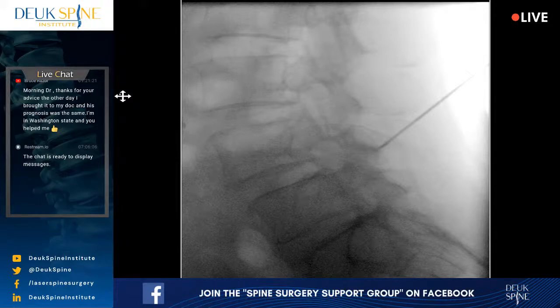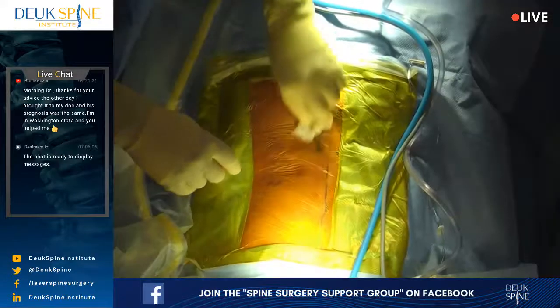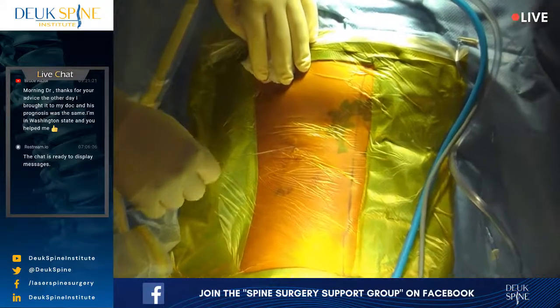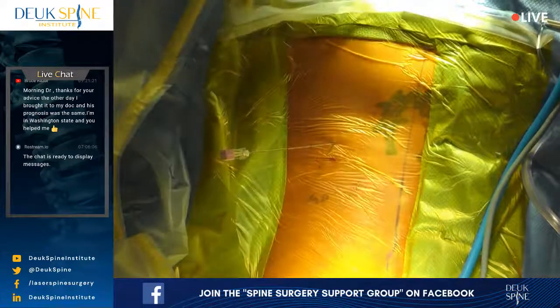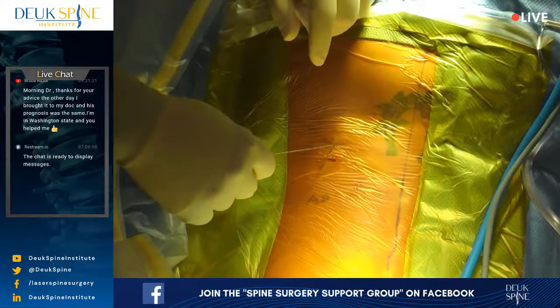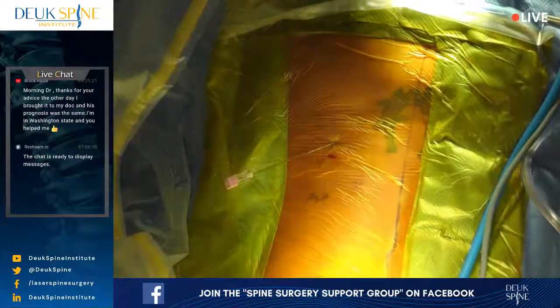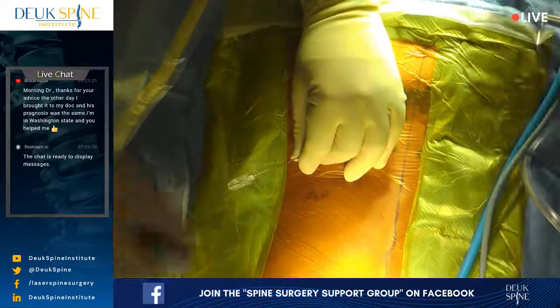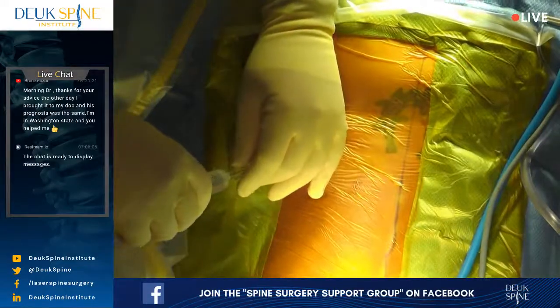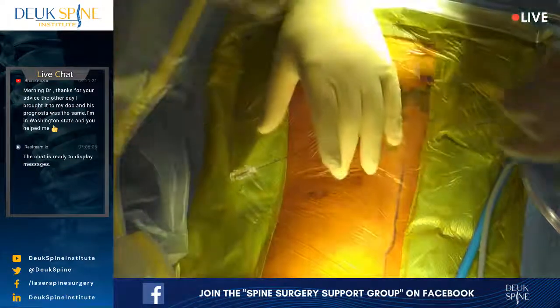You okay? Dr. Deukmedjian here. You're doing great. We're just getting everything set so that we can do this thing perfect for you. You're going to be awake for the first 10 minutes, 15 minutes until we get to where we need to go. I need your assistance, okay? So I'm aiming for the L5-S1 foramen. And if it's uncomfortable, let me know. I'll give you a little more numbing medicine. Okay? And that should make you feel better. Now, we can't use any numbing medicine down by the nerve root, but we're not at the nerve root. That's just some numbing medicine.